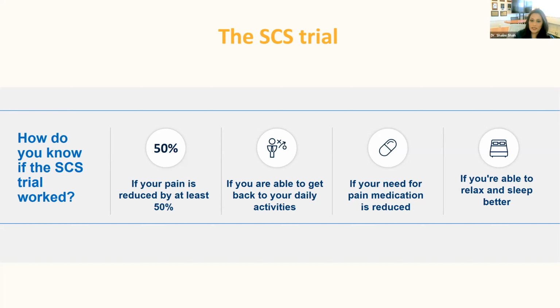I have patients who come in and say, I've been on these opiate medications for decades, and now with the stimulator, I just didn't need as many. I was able to go from 4 pills a day down to 3 pills a day. That's a big victory, coming down on your medications. So those are the three things that I'm looking for principally. I also ask about sleep. Sleep is so vital to pain and pain functioning. So if you're able to get a good night's sleep for the first time because you had good pain relief, again, that's another great victory, right?